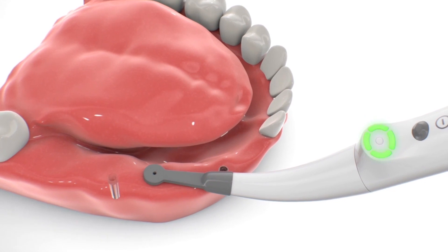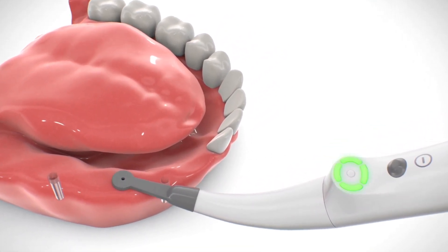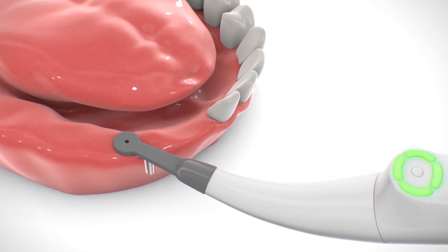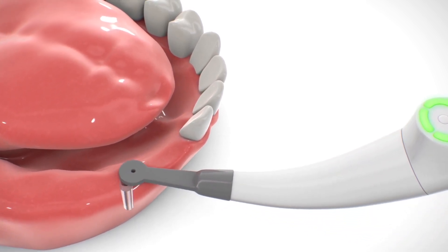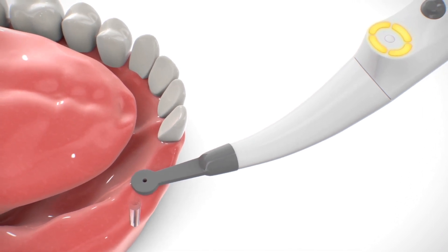Slowly move the sensor along the jaw towards the estimated position of the hidden implant. When approaching the implant, four segments turn a steady green. Continue smooth movement of the sensor in the same direction without stopping until four segments turn orange, indicating that the sensor has passed the implant position.